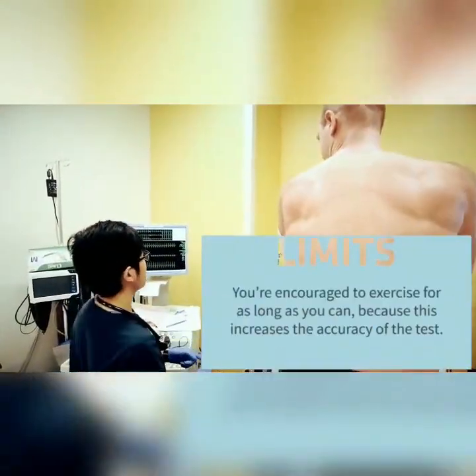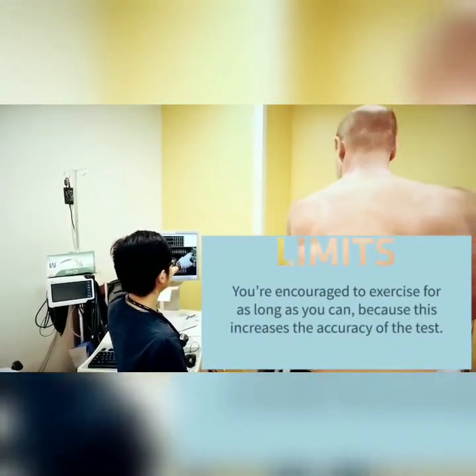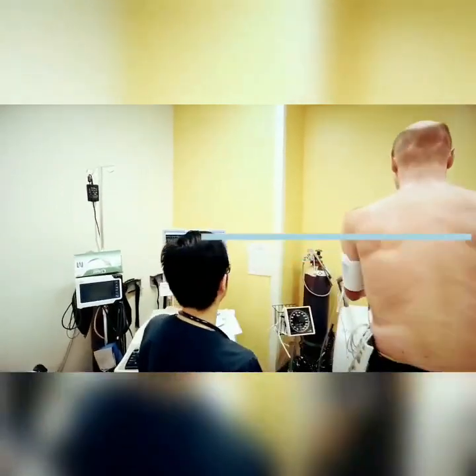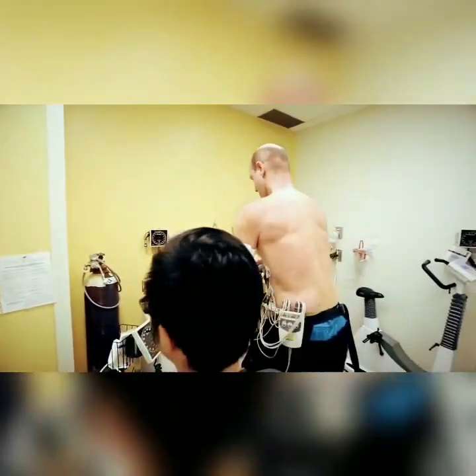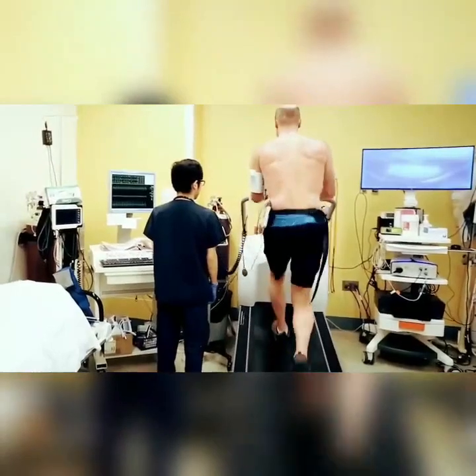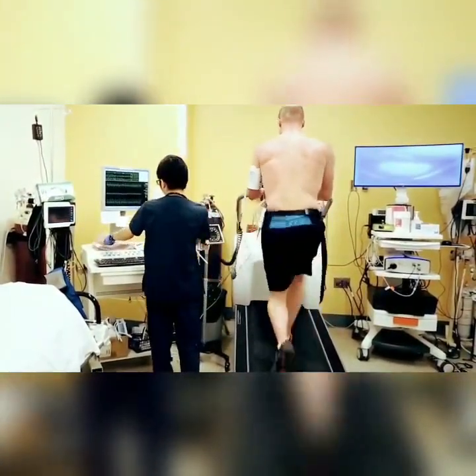Your calculated maximum heart rate is 146. Okay. Yeah, so you went over that, so it shows as red to let us know you went over your target, which is good. We would actually like patients to go for as long as they can, right? Yeah, I've never finished the stage. Okay, so let's try to do your best, okay? Yeah.